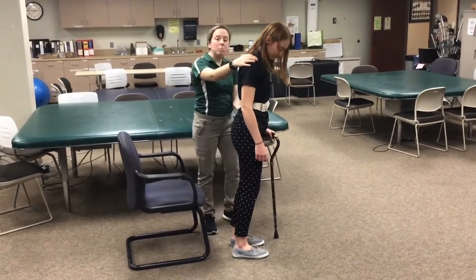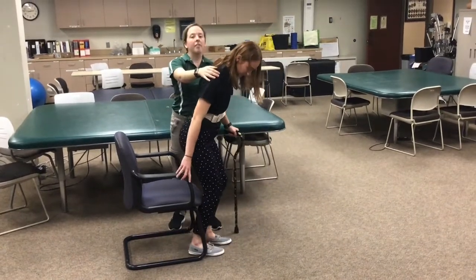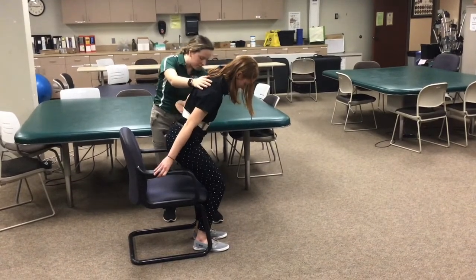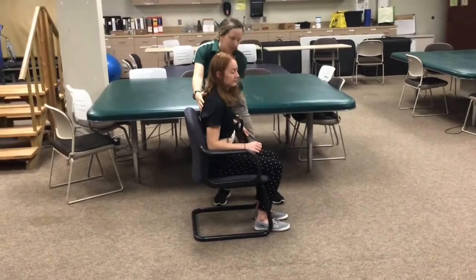And then they will back up until they feel the chair on the back of their legs. And then they will reach with, and can you reach with your free hand for the chair? And then can you rest your cane against the chair? And then they will slowly lower themselves down until they are sitting.